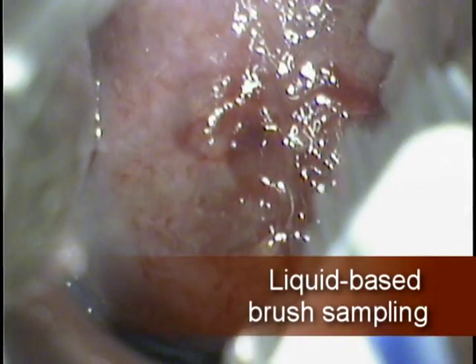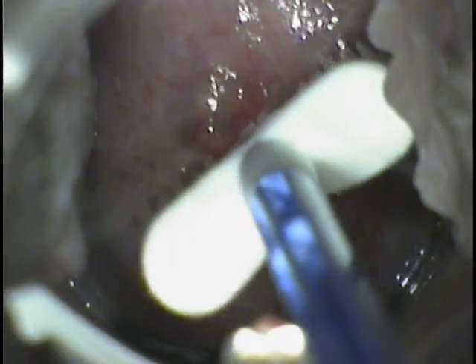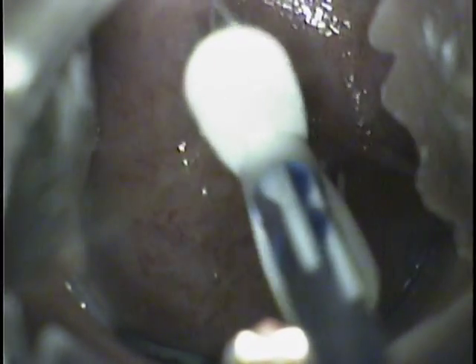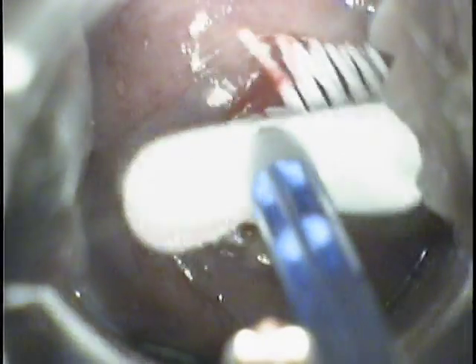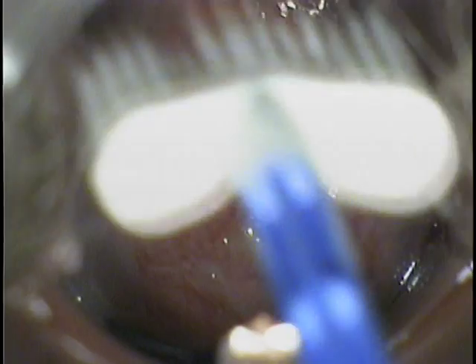Commonly use the broom-shaped Pap device with the wet prep and HPV sampling. Place the point of the broom within the os and rotate the brush five times to obtain a sample. Remove the tip of the brush and place it within the wet prep container. Send this sample for both cytology and HPV typing as indicated.